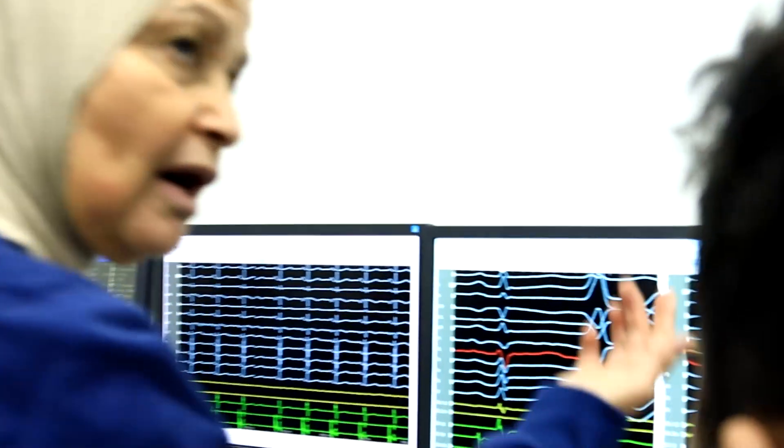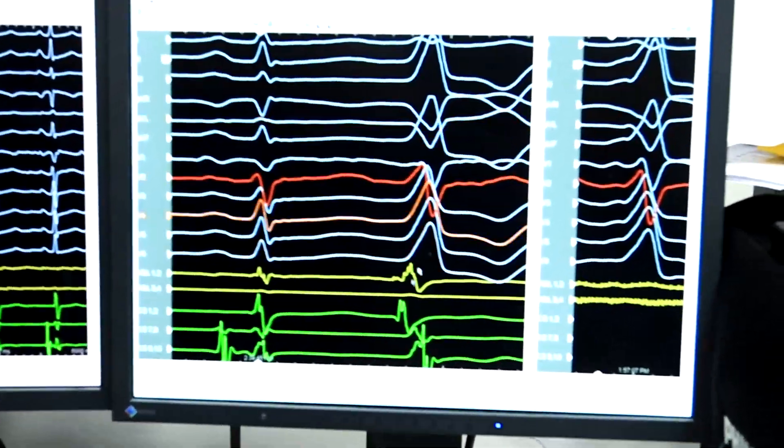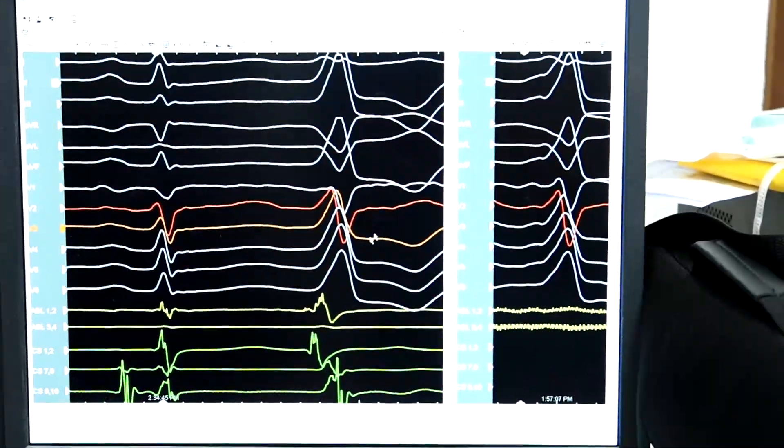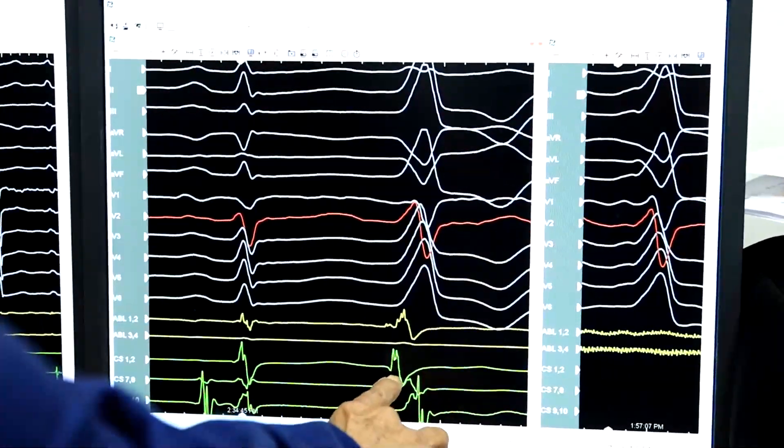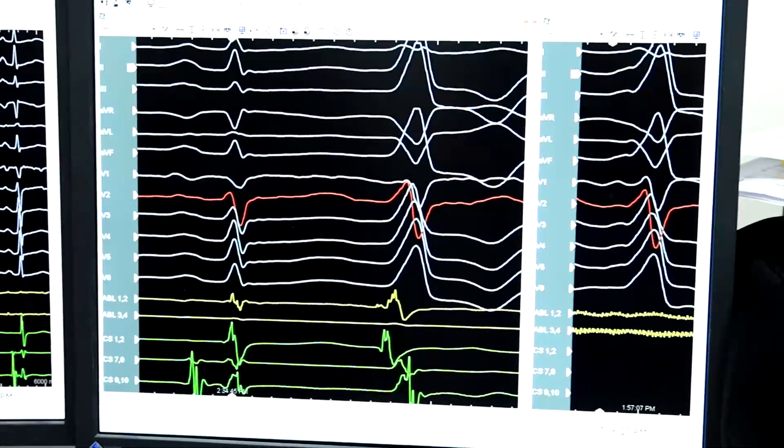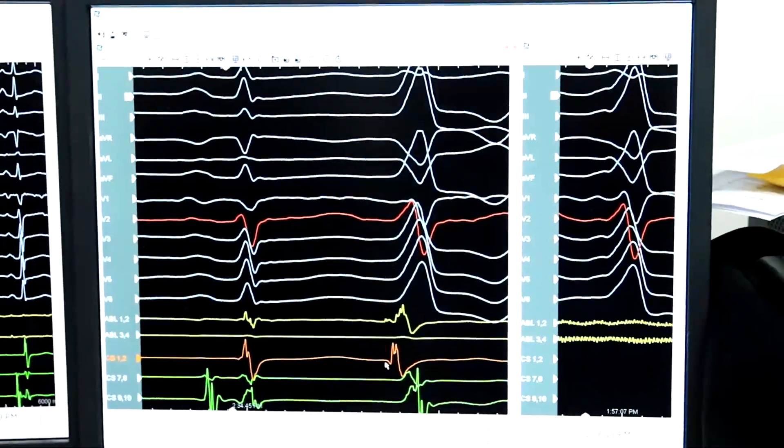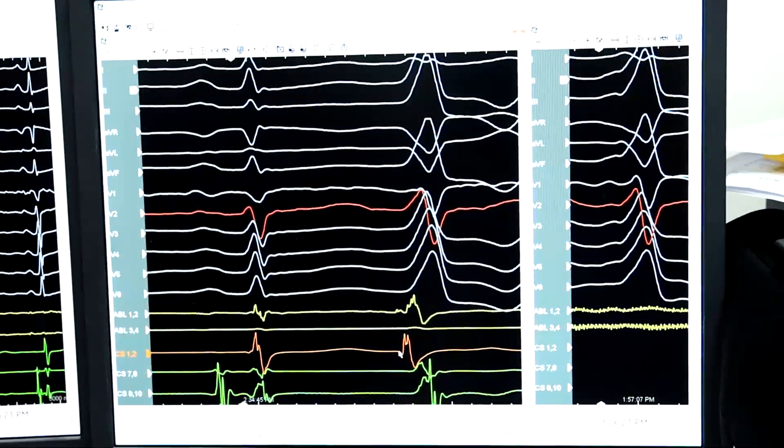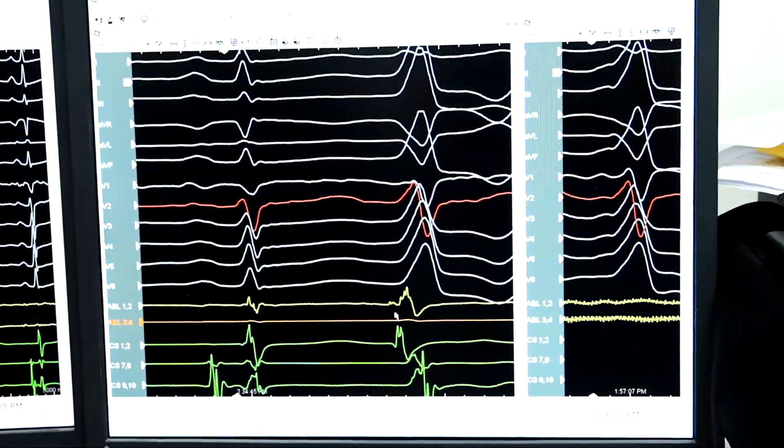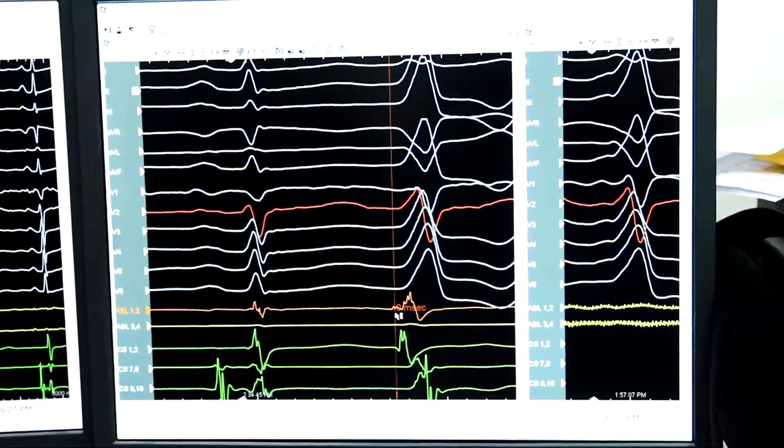We introduced the CS catheter. Actually Salah introduced it high up. We saw it, we'll see it in fluoro. We can see that the distal CS was getting very early ventricular electrogram. We mapped all the localization mainly in the left side, so went to the retrograde approach to the aorta. We mapped it to be in the right coronary cusp.